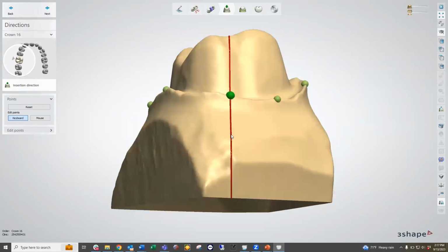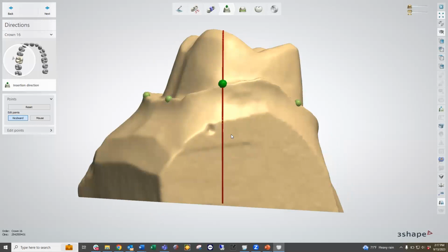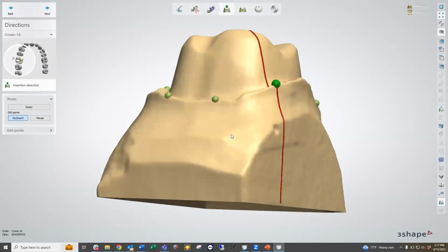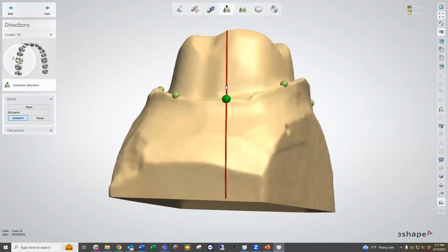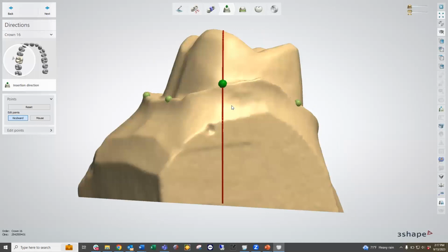I'm just using the left or right arrow keys on the keyboard. I can't really move this dot with my mouse, left or right. It does not use the mouse at this point. So instead, I'm just using the keyboard, and I can use the arrow keys up or down to move this dot relative to that red line that we see on the screen. I'm not able to move it left or right. Rather, it selects a different dot to the left or right, and I can move it just relative to that red line.